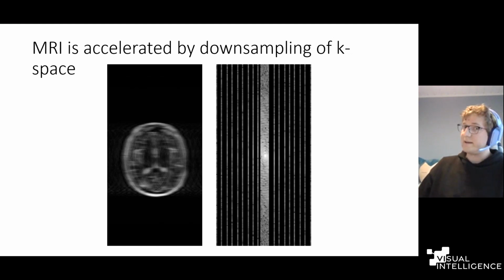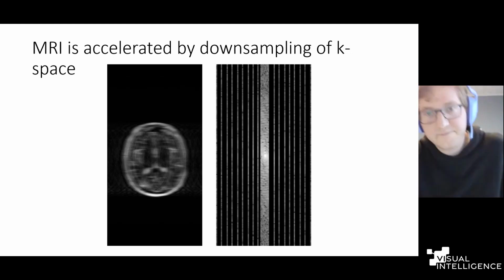The problem is that it also introduces some aliasing artifacts. The image is no longer of clinical quality and it's quite useless. It doesn't really matter if you're able to accelerate the scan if you can't make the image look decent.